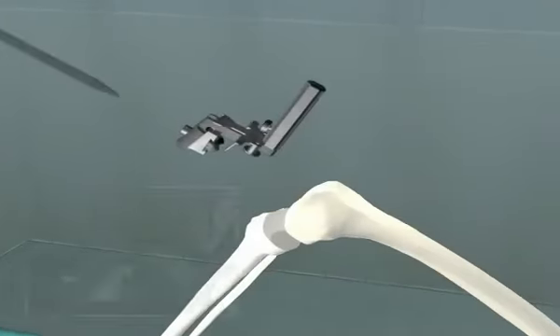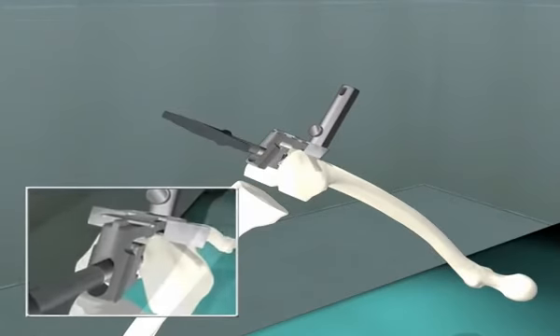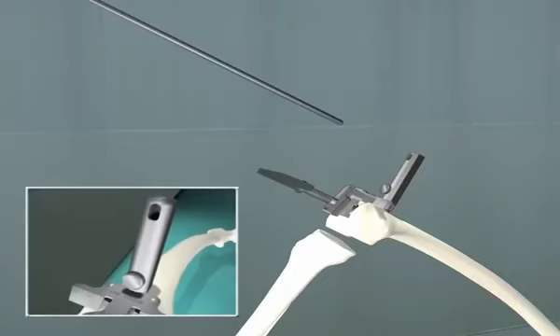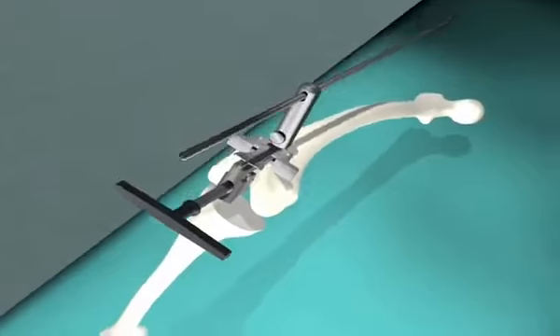The distal femoral resection proceeds after placing the referencing guide into the intramedullary canal, and the alignment rod can be passed through the guide and aligned over the femoral head center.